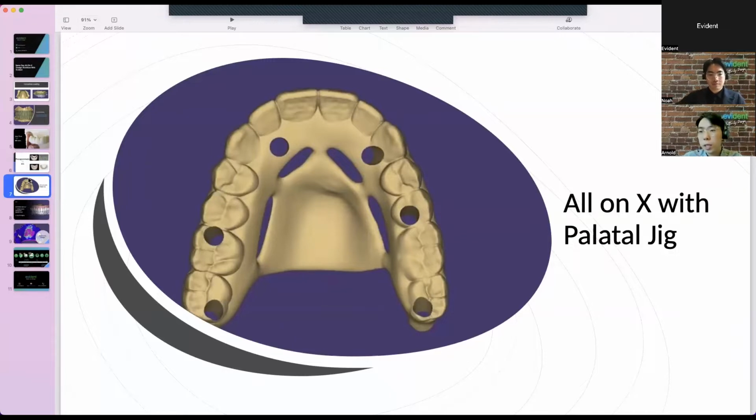You can consider it a denture conversion to implant. So we have this design as a backup. If the bridge doesn't fit, you can use this. You can engage these Ti bases, pick up with the bigger access holes, and cut all those shoulders off the hard palate. Then the patient can have this temporary bridge.